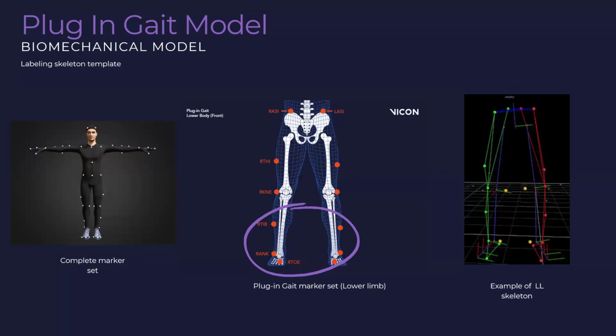It depends on the age actually, because when you're a very young child, you're learning to walk, so the center of pressure is not accurate. But children above 5 or 7, when they know how to walk, there's no issue. The physiology is the same, the size of the thing is different, and just the duration is different.